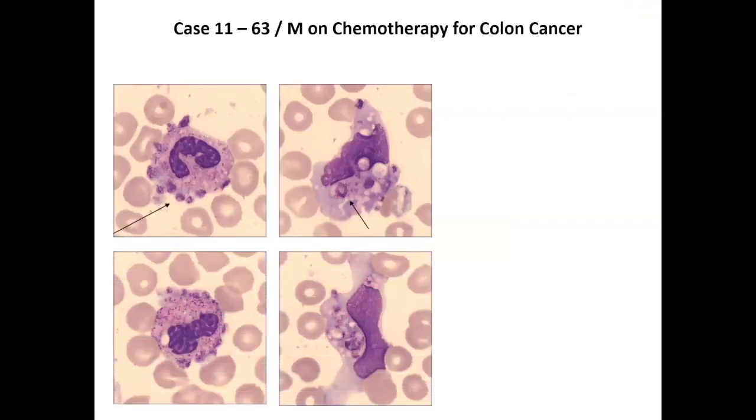When I saw this on the digital microscope, there was not only platelet satellitism, where you can see the platelets around the neutrophil, there was also platelet phagocytosis by the monocytes, and that is what we reported as a pseudothrombocytopenia. Again, I told the clinician that the platelets look adequate on smear because of this platelet satellitism and platelet phagocytosis, most probably induced by the previous chemotherapies that the patient has got. So he can go ahead with chemotherapy. So this helps a lot.